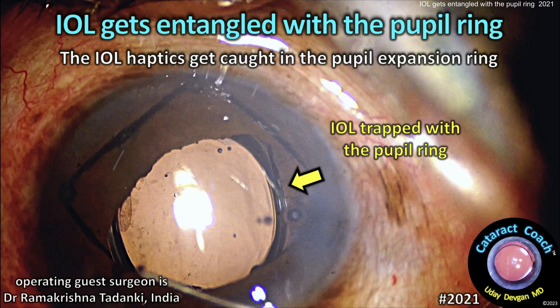cataractcoach.com. The IOL gets entangled with the pupil ring. How are you going to free this one up? Let me show you the case here.